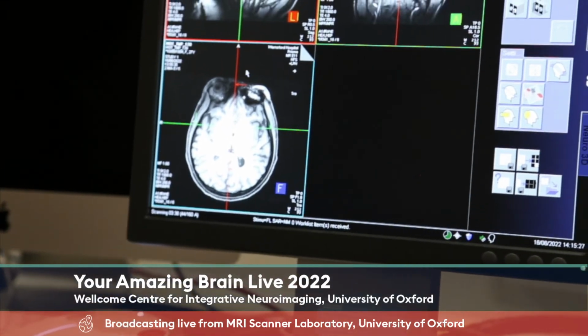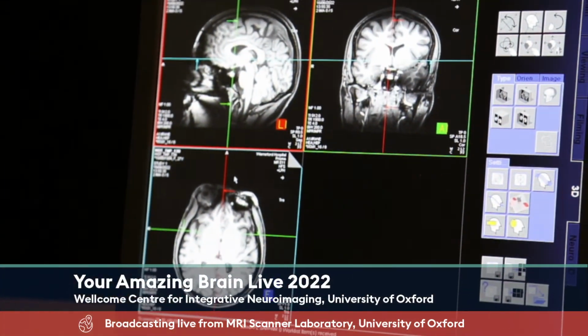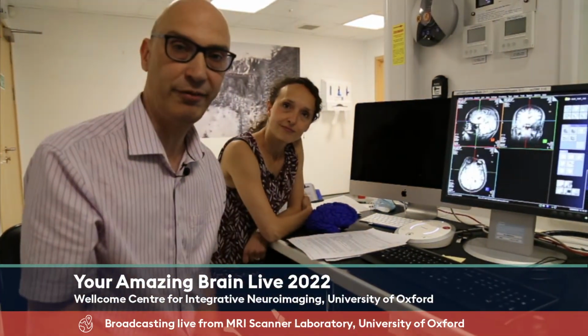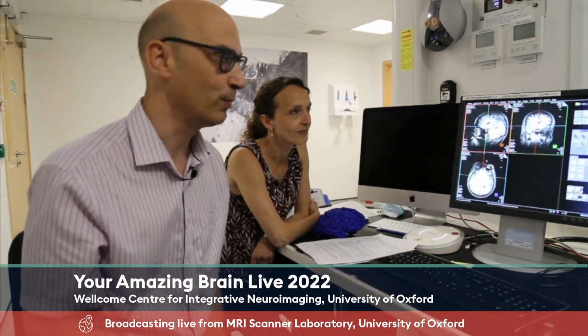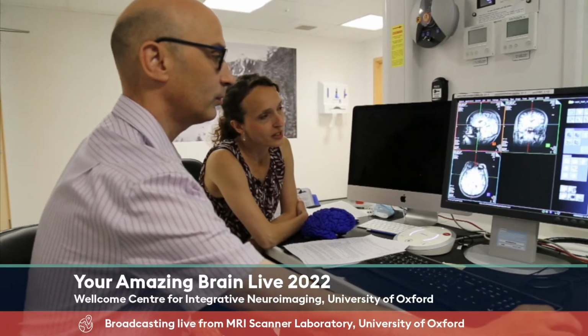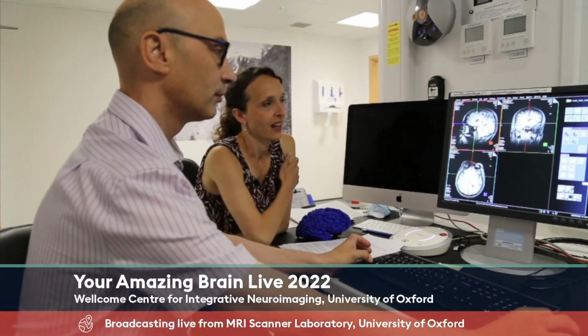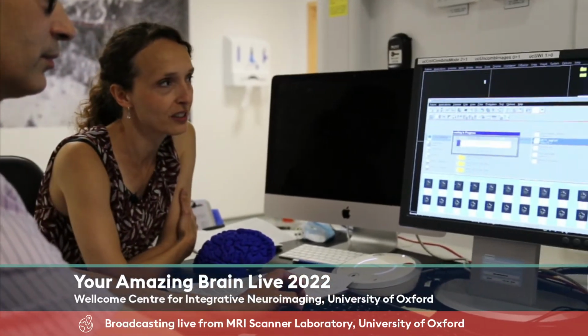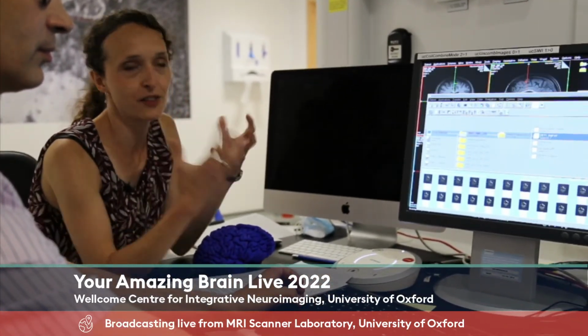So that's a bit about what the brain is looking like, but to know which parts of the brain are working hard and are reacting to that fear from looking at the octopus, we need to look at something else. So explain that, Miriam. Yes, right now we're taking a different kind of measurement. This is a static picture of the structure of the brain we were just looking at, but what we're interested in is where the brain activity happens.